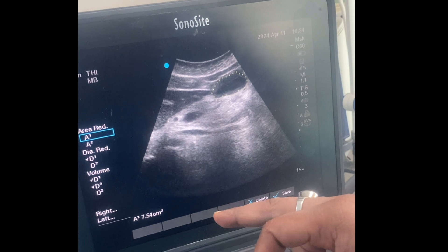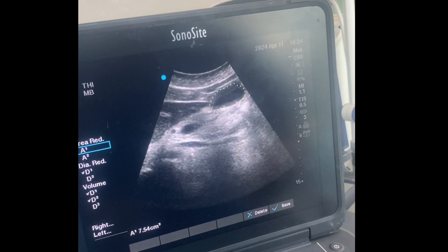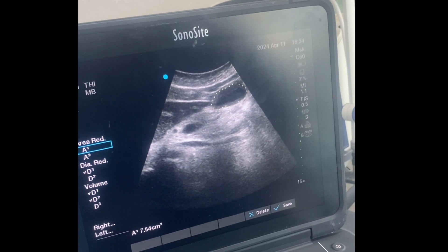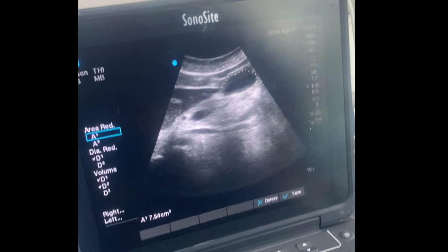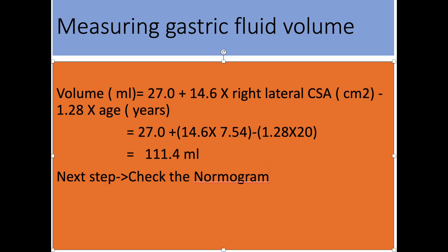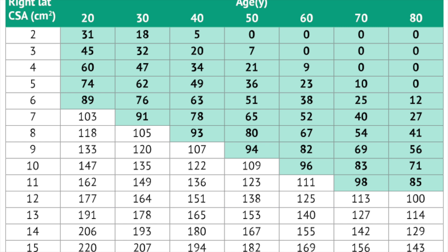The cross-sectional area is 7.54 cm². The patient age is 20 years. When you put these findings into the formula, you get a gastric volume of 111.4 ml. This finding is also consistent with the value of the nomogram — if the cross-sectional area is between 7 to 8 cm², the gastric volume is approximately 111.4 ml.